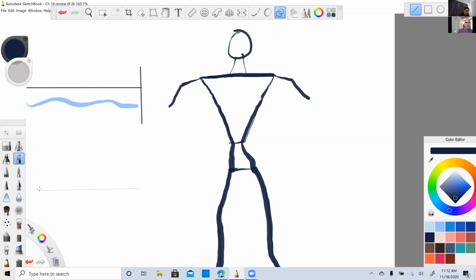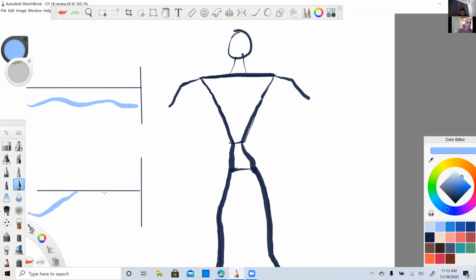And then we also have the very real possibility of breathing, especially if you hold your breath, producing waves doing something more like this. I didn't give myself a whole lot of room here, but that's basically showing blood flow in the correct direction below the baseline, then completely stopping, and then starting again. And that happens with breathing.